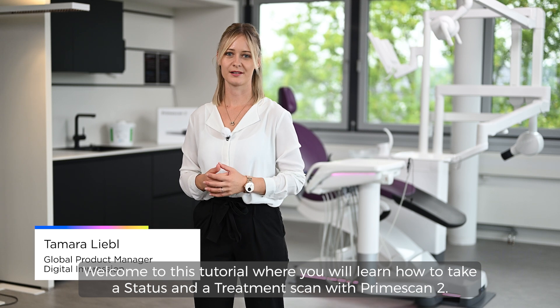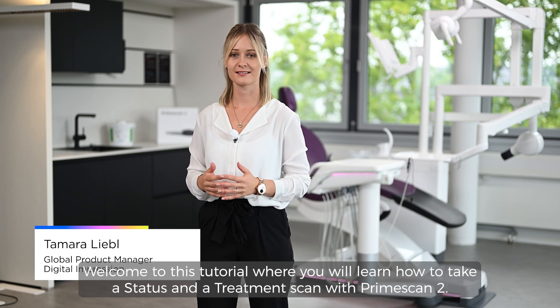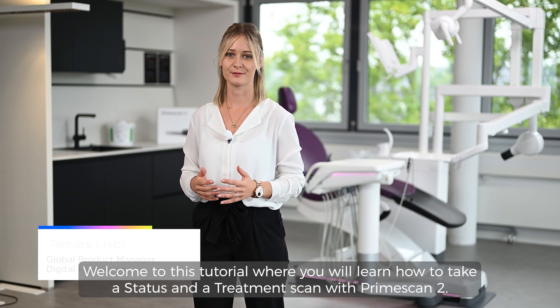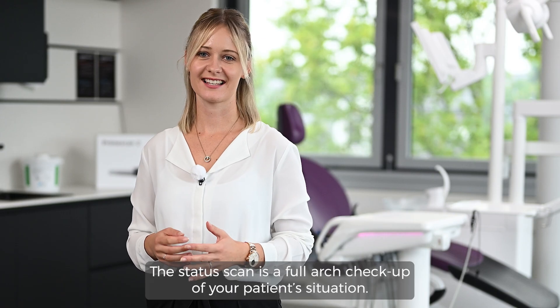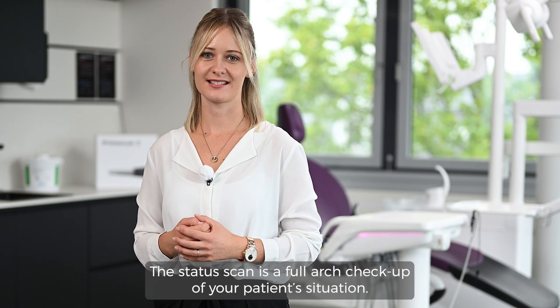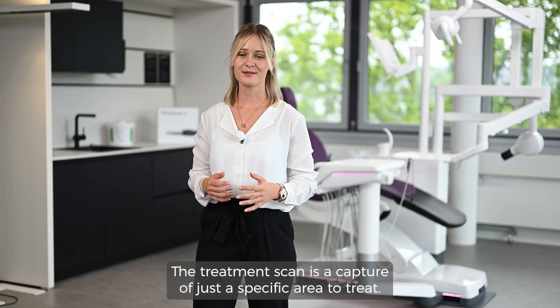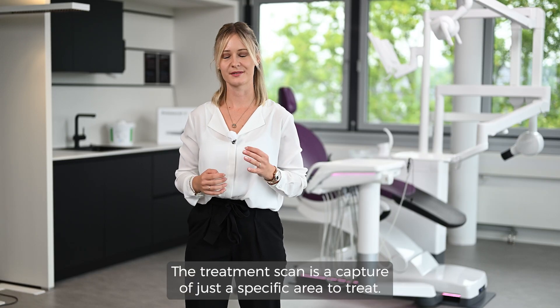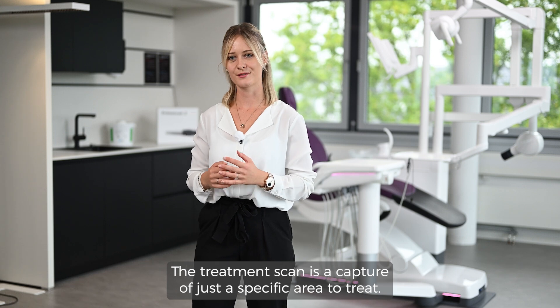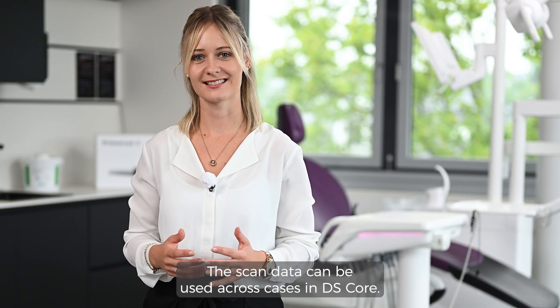Welcome to this tutorial where you will learn how to take status and treatment scans with PrimeScan2. The status scan is a full-arch checkup of your patient's situation. The treatment scan is a capture of just a specific area to treat. The scan data can be used across cases in DSCore.